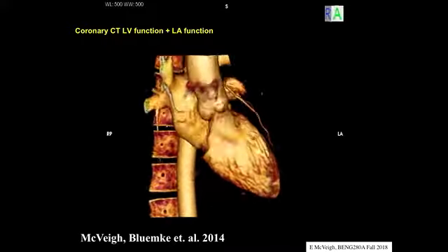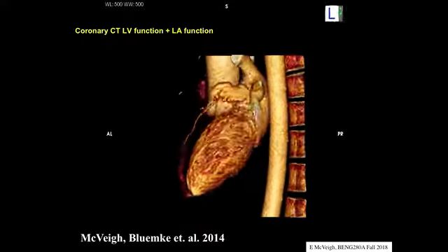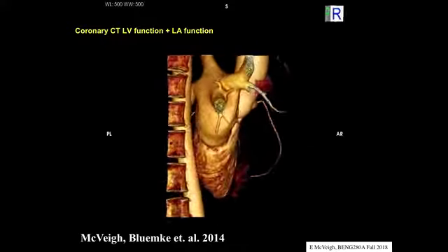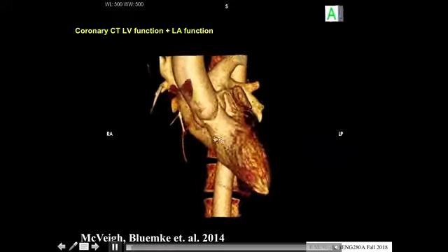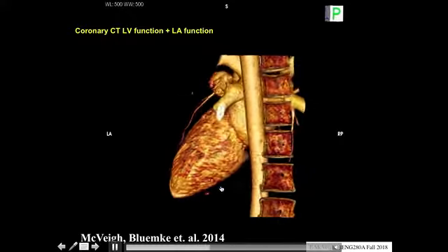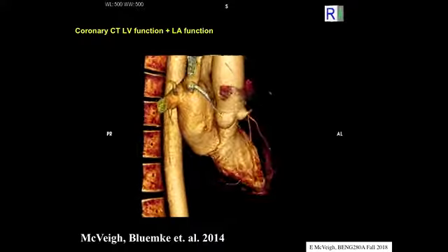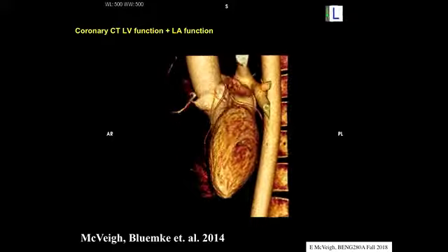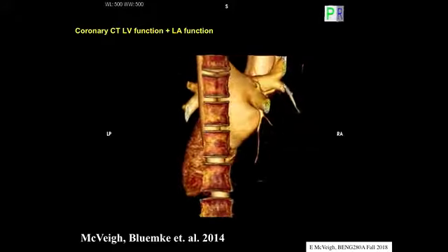And then we'll play them back just as a movie. It's that easy. It's pretty trivial, right? And when you play them back as a movie, you can see natural phenomena occurring like cardiac contraction, right? So the bright signal here is the blood in the left ventricle, right? And so as the left ventricle squeezes down, the blood volume gets smaller, and you can see that occurring here. So you can see the cardiac function pushing that blood down to become a smaller volume.